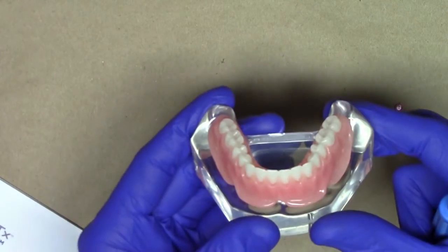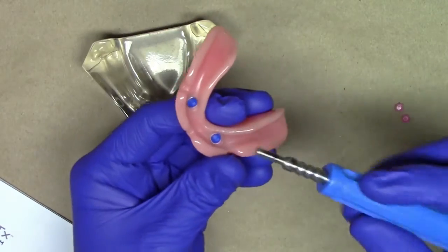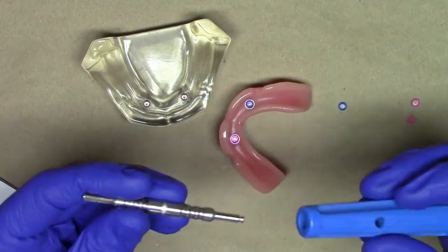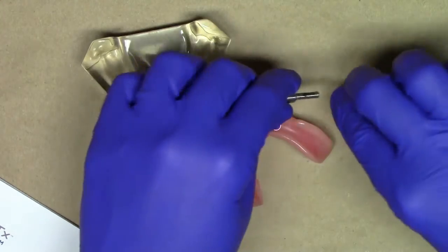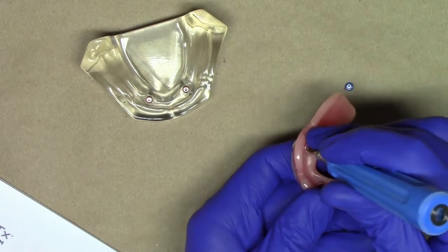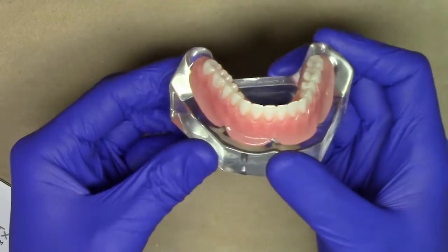On the flip side — if you say, 'That's a lot better for you to take it out, but maybe it's a little too loose for you right now,' it's the same thing. I just take my tool, take the outside, flip it over, push, twist, insert, and remove. In literally just a few seconds, I can insert the medium retention back in, and now my patient has the original retention they asked for — excellent stability — and is ready to be dismissed.